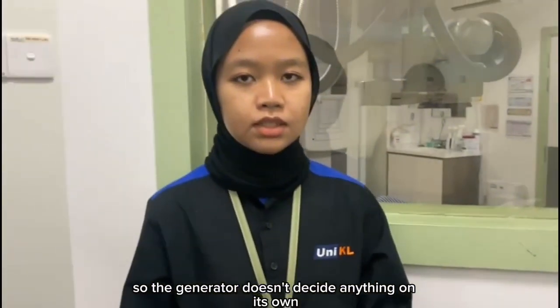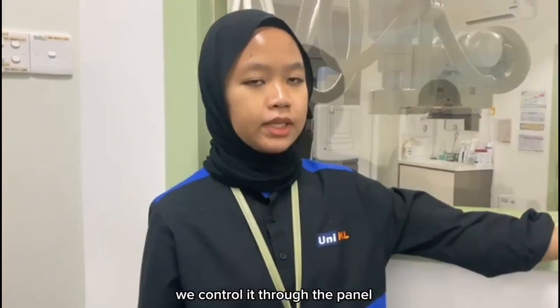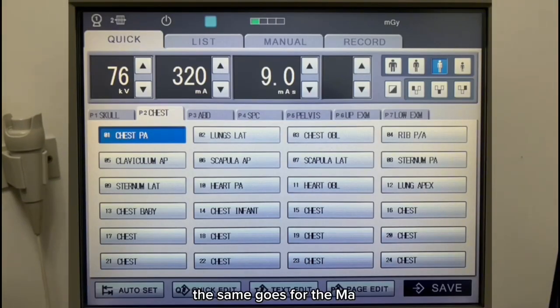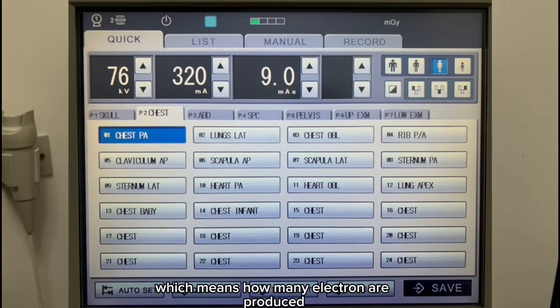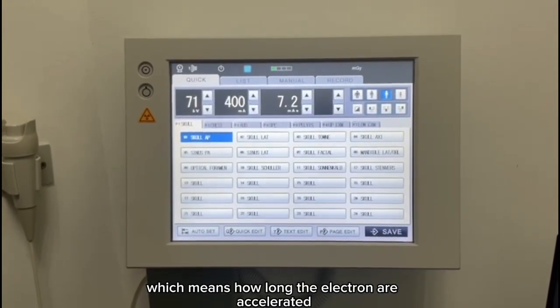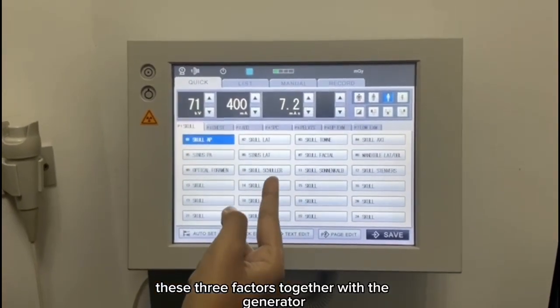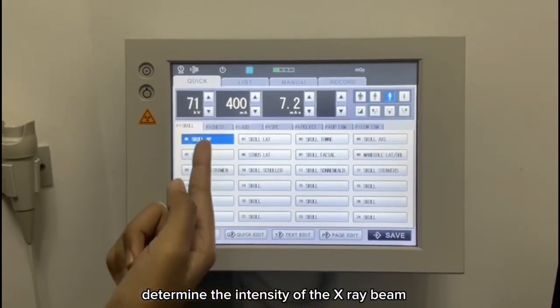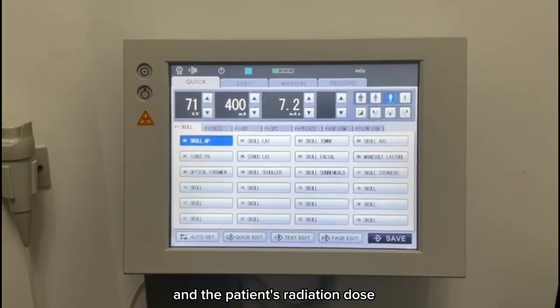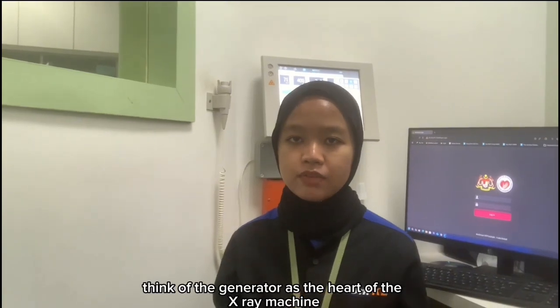So the generator doesn't decide anything on its own. We control it through the panel. The same goes for the MA, which means how many electrons are produced, and exposure time, which means how long the electrons are accelerated. These three factors together with the generator determine the intensity of the X-ray beam, the contrast of the image, and the patient's radiation dose.